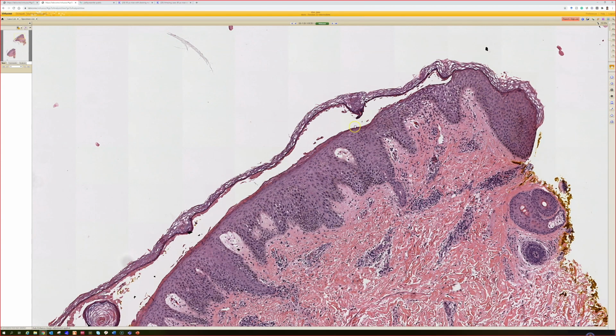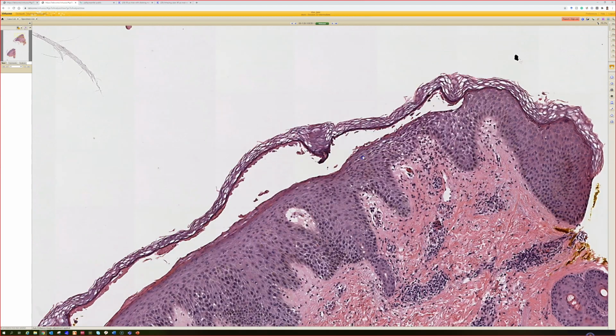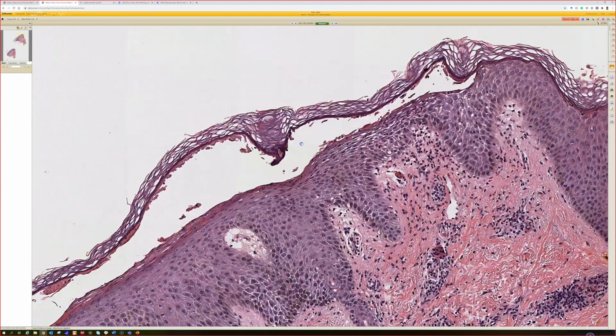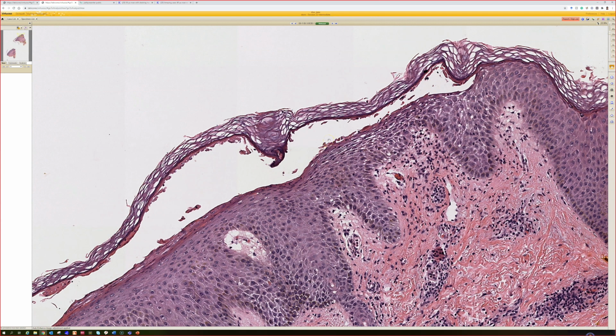bullous impetigo. There wasn't really much in the way of solar elastosis, and the collagen looks pretty bright pink and crisp. So I was thinking maybe more like kid skin, either staph scalded skin or bullous impetigo. Good. Plus also the chapter that we're in, infection. That's always a good clue, knowing what we're supposed to be studying.